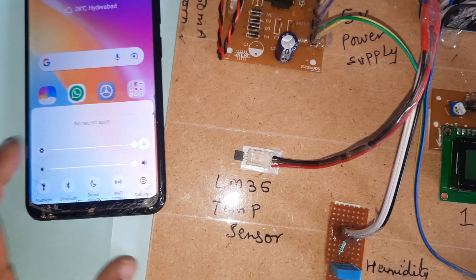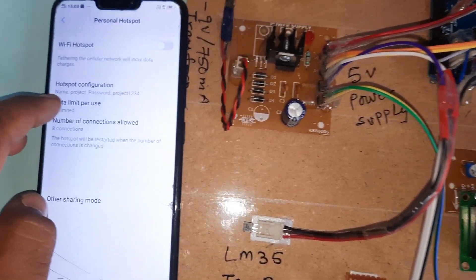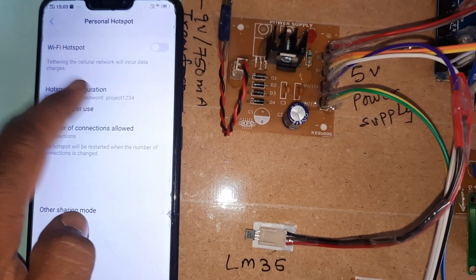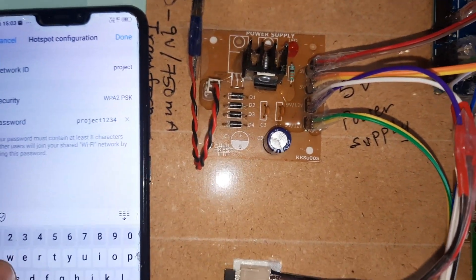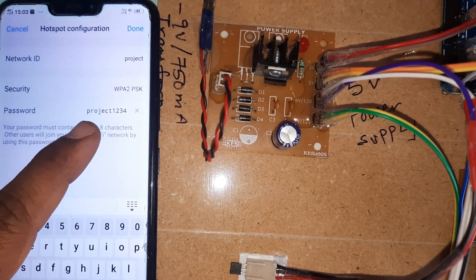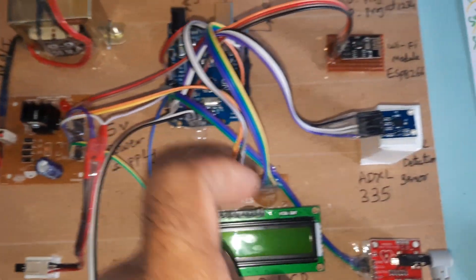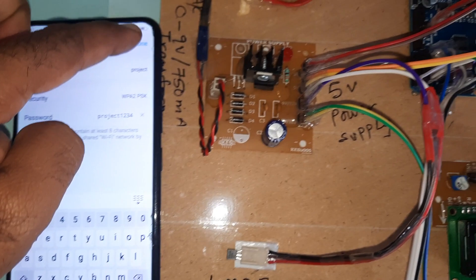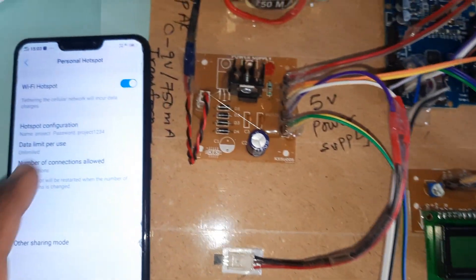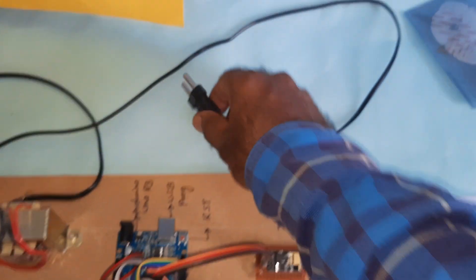The WiFi hotspot SSID is 'project' and the password is 'project1234'. These credentials are already loaded into the Arduino board, and the mobile WiFi hotspot is now on.